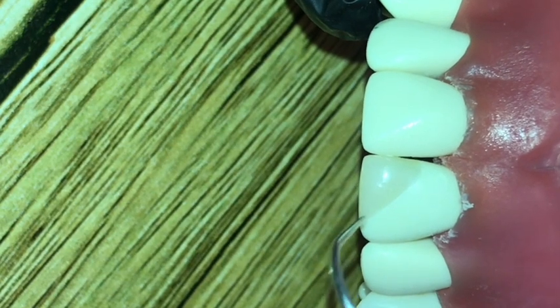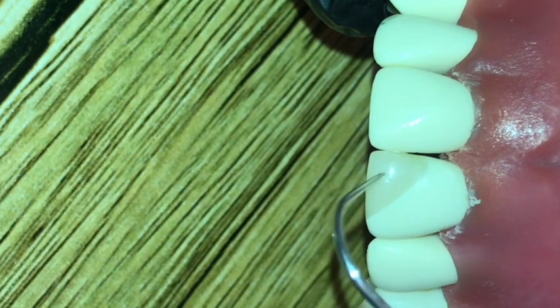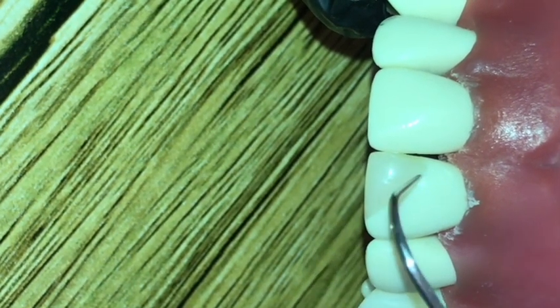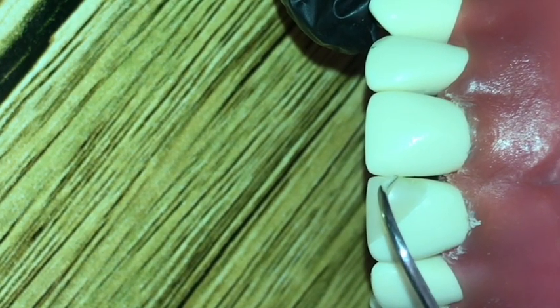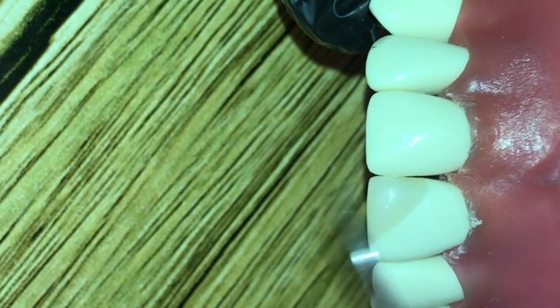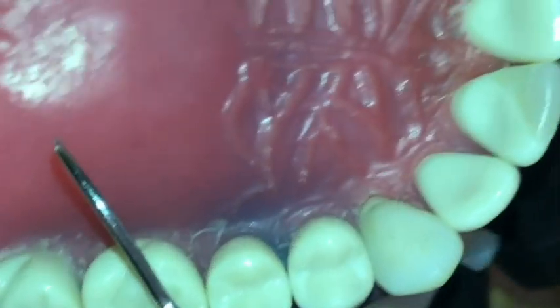Also, there should be a continuous contour between the natural tooth and the restoration. And looking at your contact area, the width of the contact area or point should be at the junction of the middle and incisal thirds of the tooth.